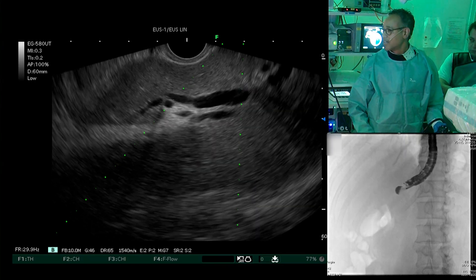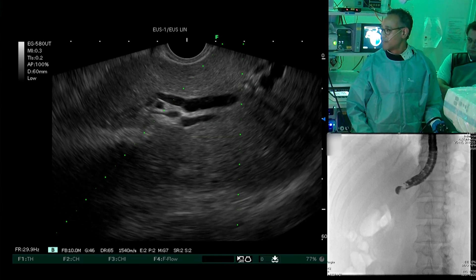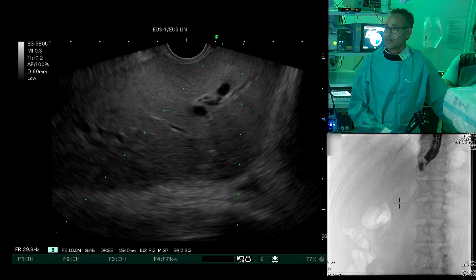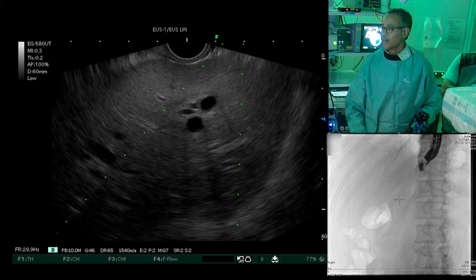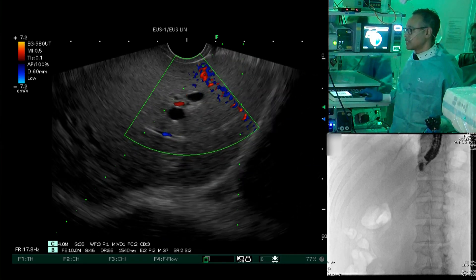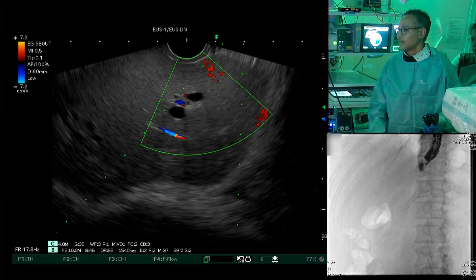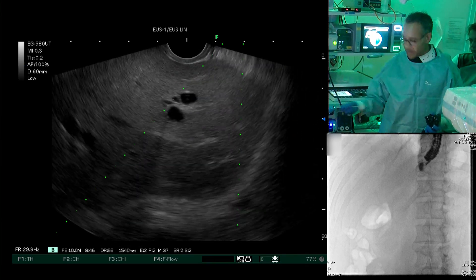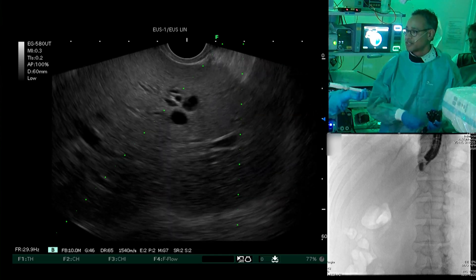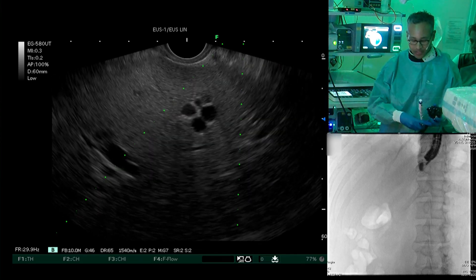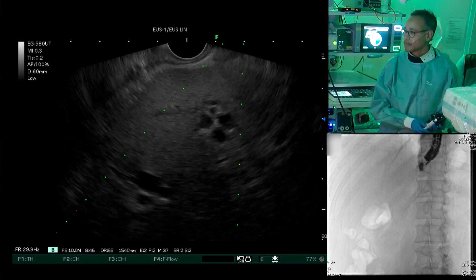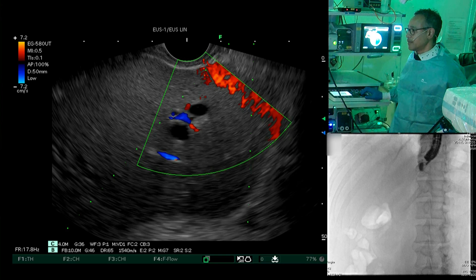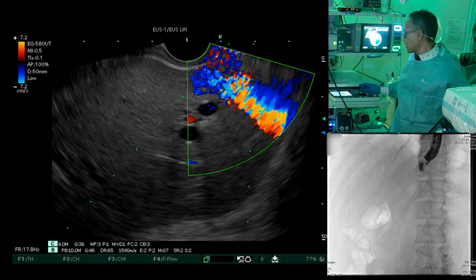I'd like the 19-gauge needle for access in combination with a 0.035 straight guidewire. I'm a little bit higher up in the stomach here, and as you can see on the fluoroscopic image, it is more towards liver segment 2. We have no significant intervening vessels here. Segment 2 is in a large number of cases more in line with the common bile duct, so that's the favored approach. Be careful not to puncture through the esophagus towards the liver — make sure you're in the stomach. Focusing on these dilated bile ducts: there is no flow with Doppler, no significant intervening vessels. This is a good position.